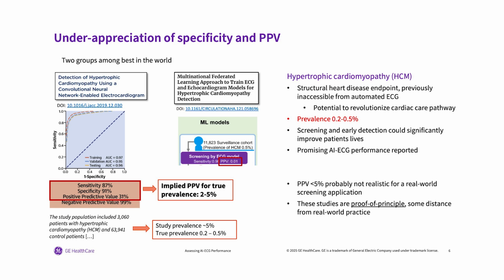90% of patients with HCM captured, when many of these ECGs are not reviewed by a clinician with a cardiomyopathy mindset, right? And the positive predictive value shown here is 30%, which seems very manageable in practice. But again, prevalence is a very confounding factor. In fact, that research is very often done, and this is very common for HCM especially, on an enriched population, a population with enriched prevalence, usually something around 5% for HCM development. That's at least an order of magnitude higher than the true prevalence.